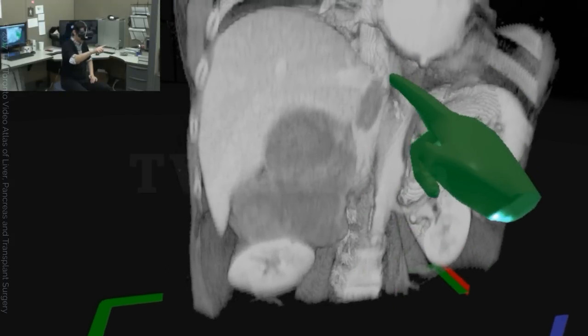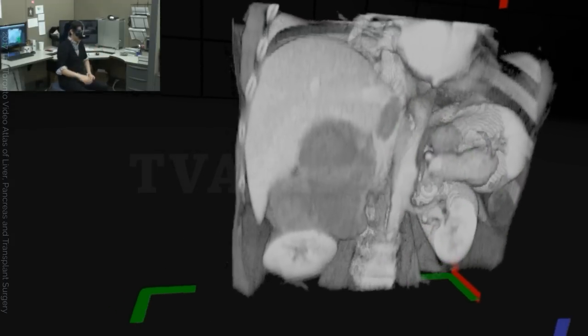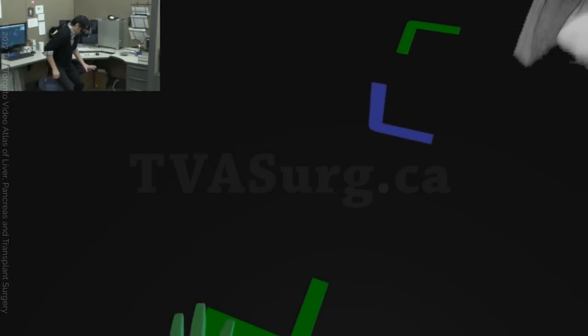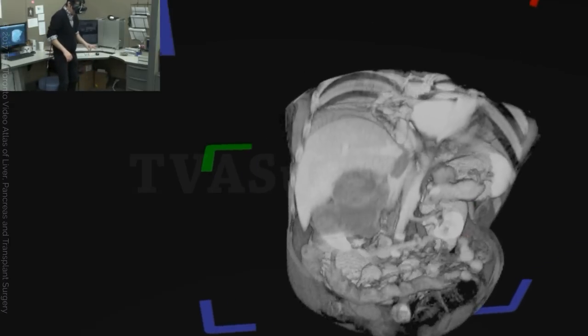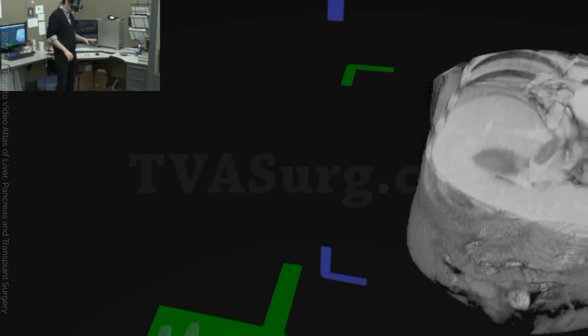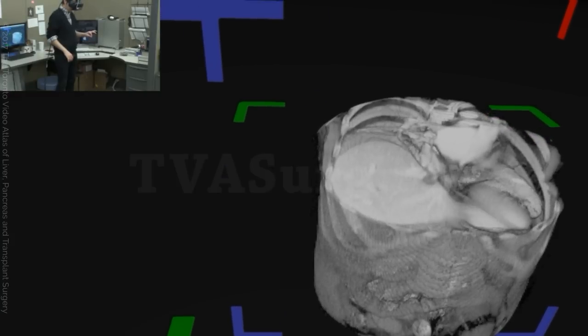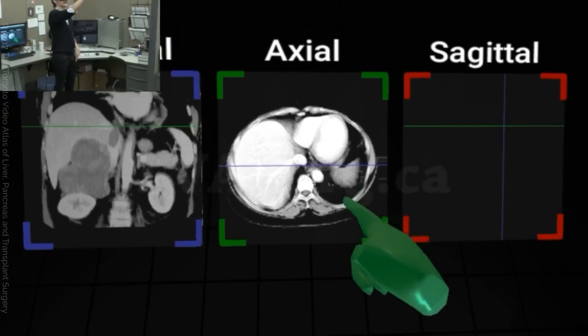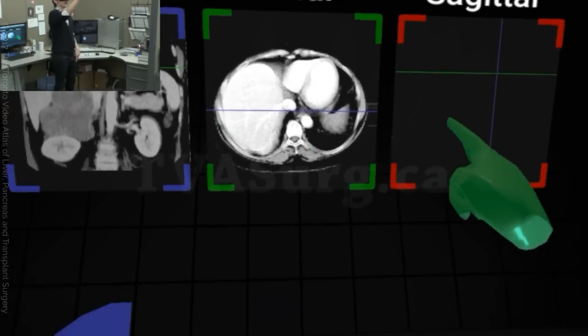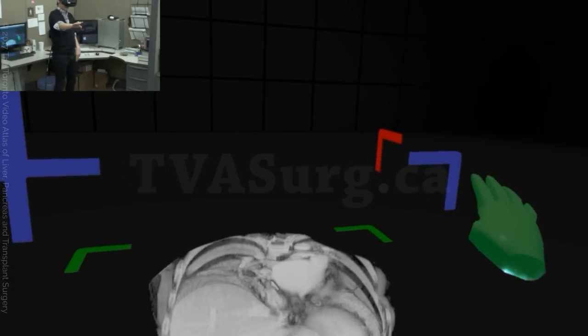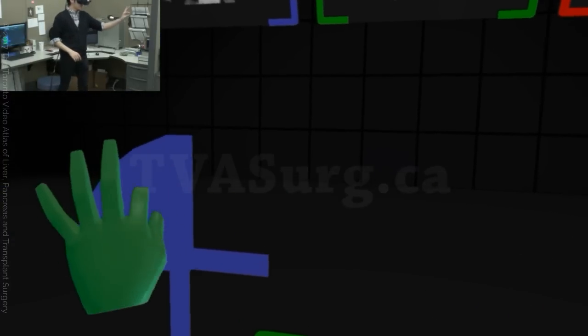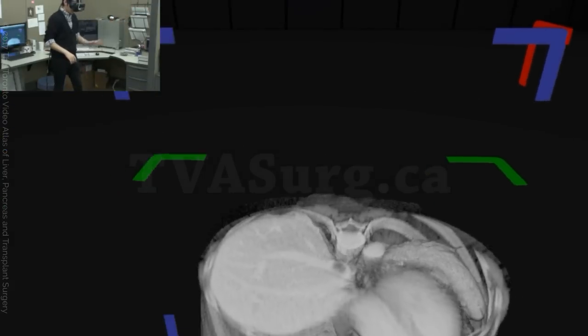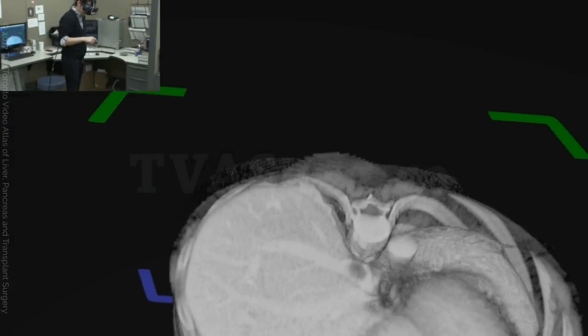We can take a better look at this if we pulled up the axial slices. So on the axial series, you'll notice a thin blue line. This represents where the coronal plane is cutting our volume. And if we just push it back a bit, you see here again the black mass we just saw.